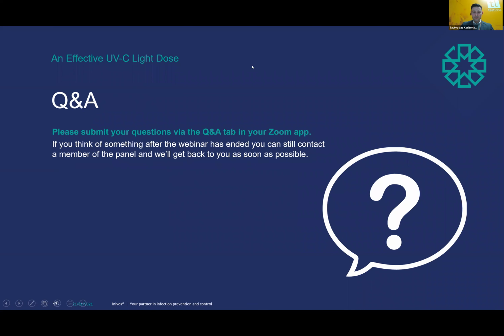So I think we're going to go into the Q&A session to see if there's any question. I think there's one question that says, is there an accepted minimum dose and range of doses for SARS-CoV deactivation? Would you like to go and answer that, Enrico, based on all the literature reviews? I suppose the question is, is there a minimum dose that you would expect to see for SARS-CoV-2 disinfection? I think from your previous slides, it was suggesting that 148 millijoules per square centimeter was the effective dose to achieve a log 6 reduction.